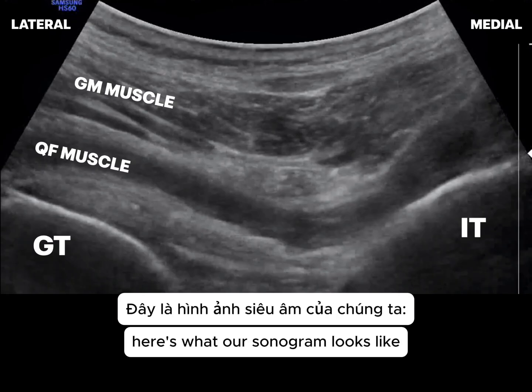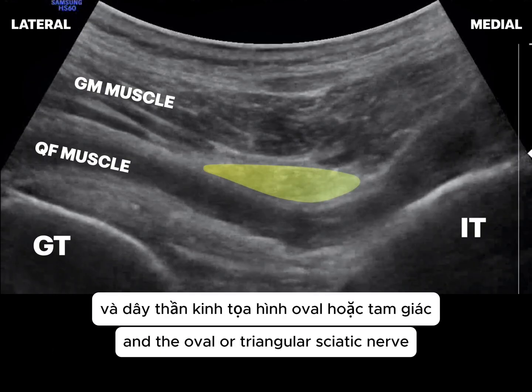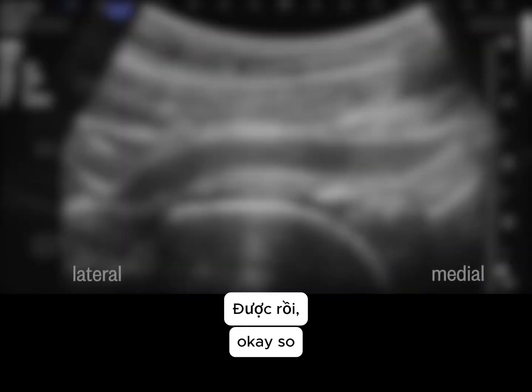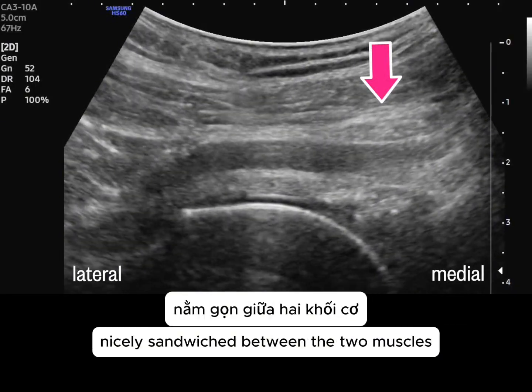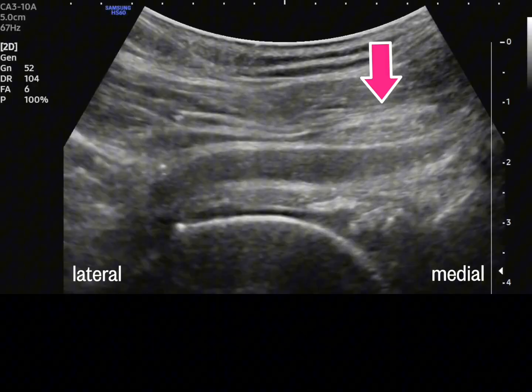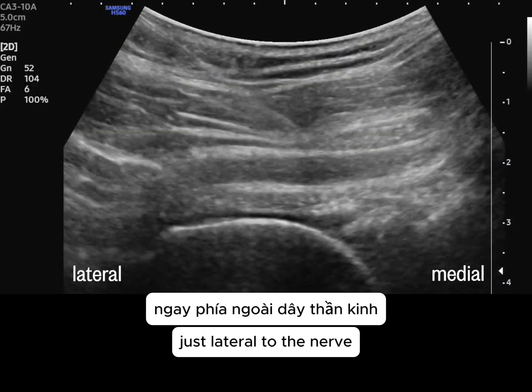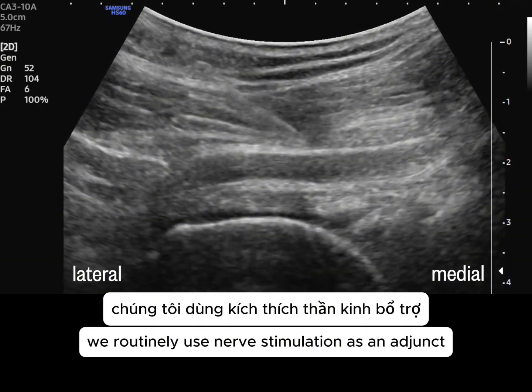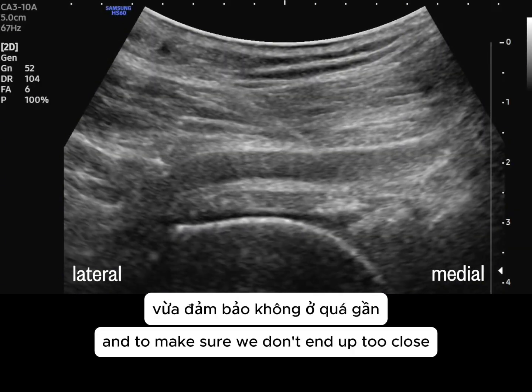Here's what our sonogram looks like. We see the hyperechoic bony prominences on either side and the oval or triangular sciatic nerve sandwiched between the gluteus and the hammock-like quadratus. Okay, so here we see the greater trochanter on the lateral side and the hyperechoic sciatic nerve nicely sandwiched between the two muscles. The needle is advancing from the lateral side, aiming for the fascial plane just lateral to the nerve. Sometimes the nerve is just not that obvious, and for that reason we routinely use nerve stimulation as an adjunct to both find the nerve and to make sure we don't end up too close.